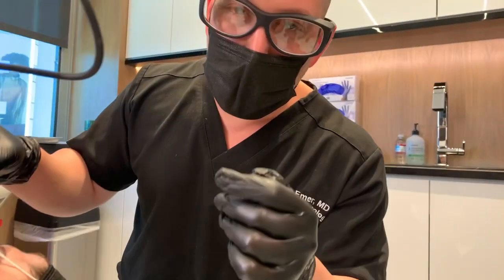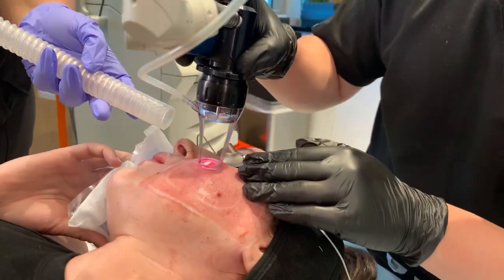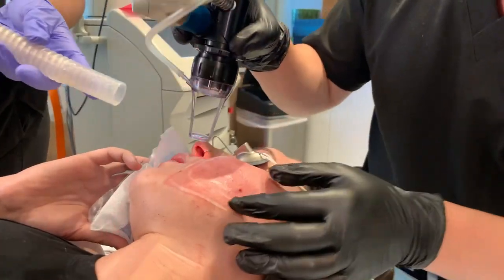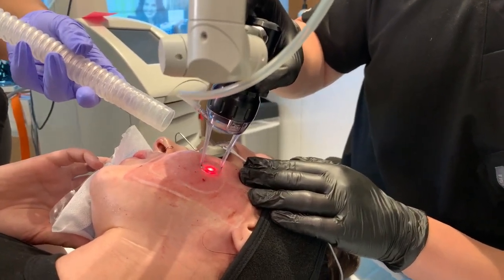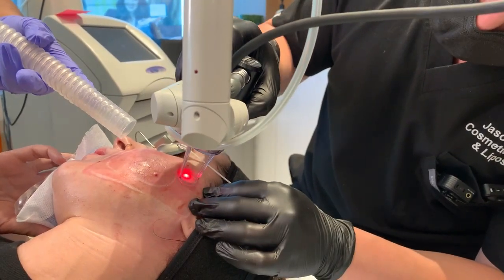I want to show you what I'm doing right now. We are now on to our laser portion of this acne scarring combination. We did Bellafill first for some of the deep scars, and you can see the Bellafill filled everything out. I mean, it actually did a really good job. Now we're using the Deep FX laser on the larger area of deep scarring, and then we're going to go on top and do the superficial active FX.